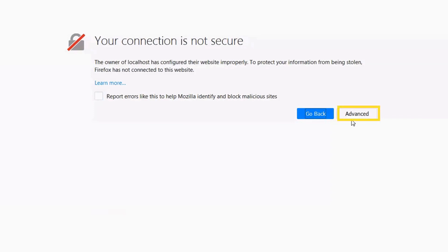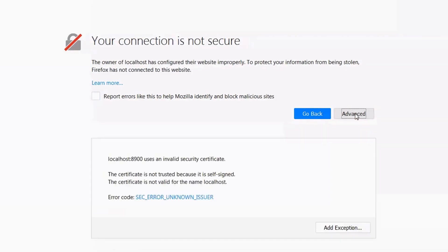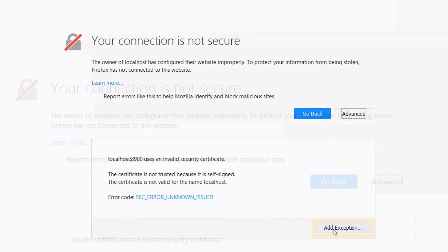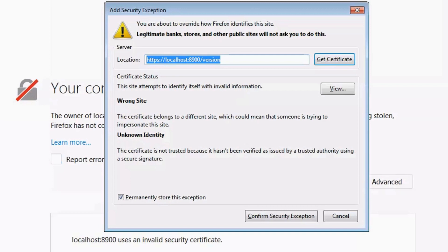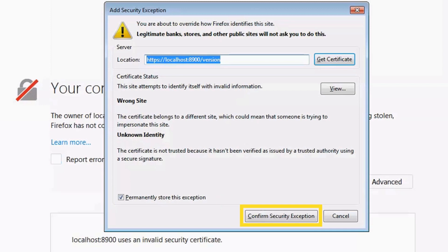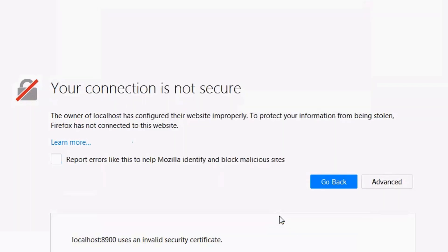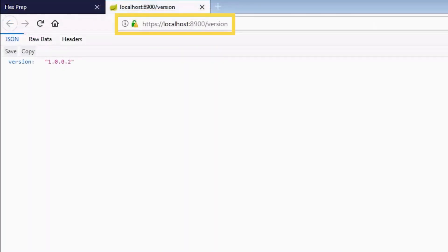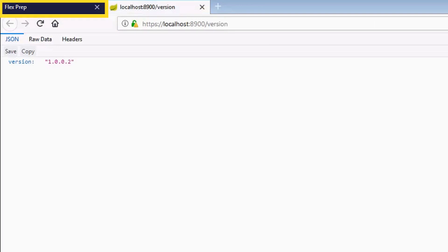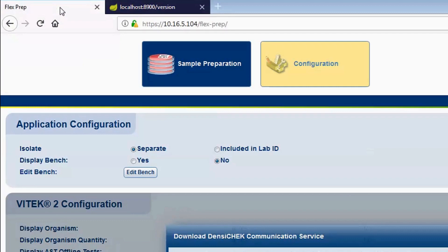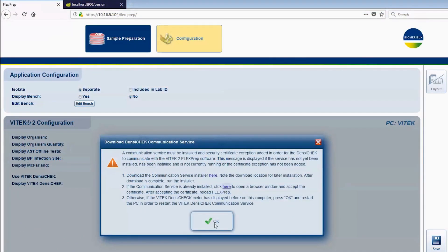Click Advanced to review information about security certificates. Click Add Exception. The Add Security Exception window appears. Ensure 'Permanently store this exception' is enabled and click Confirm Security Exception. A mostly blank screen displaying the IP address and localhost port number 8900 is normal and means the certificates have been successfully accepted. Click on the FlexPrep tab to return to the FlexPrep screen. In the Download Densichek Communication Service window, click OK.